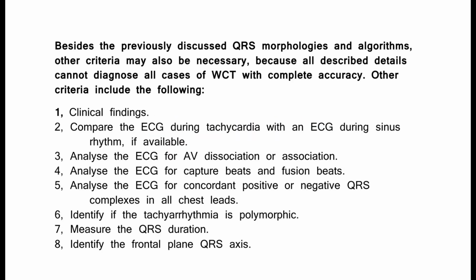Besides the previously discussed QRS morphologies and algorithms, other criteria may also be necessary, because all the described details cannot diagnose all cases of WCT with complete accuracy. Other criteria include the following.